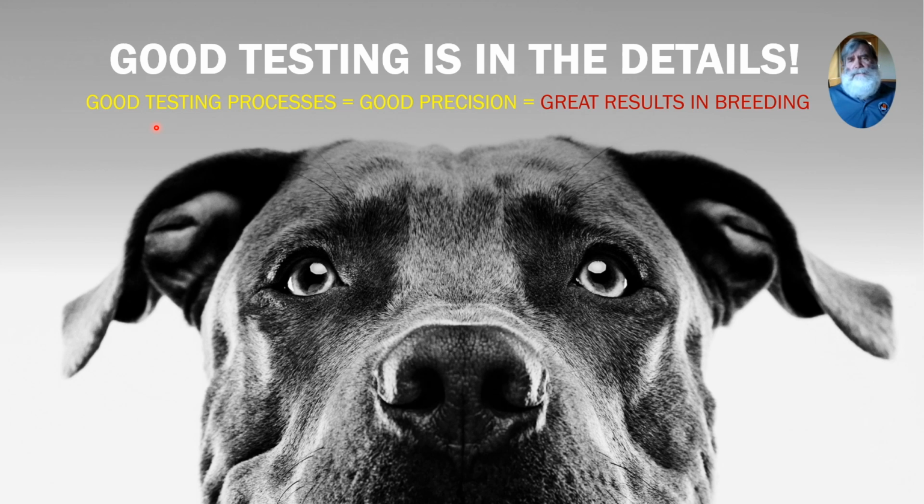Example, ovulation at 5. If your techniques are really bad, your pulls are really bad, you could get numbers from 5 to 8 on the high end and 5 to 3 on the low end. So 3 to 8 would be your range for ovulation, which would make it really hard to know when your dog has actually hit the ovulation level.